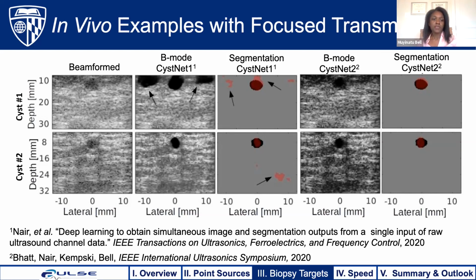So overall, this is very exciting for an autonomous biopsy system, if we want to emphasize the structures of interest, such as the cyst, and de-emphasize the speckle texture. And it's also great for showing that once we build these networks, if we get someone or some other application that requires us to preserve the structure that we initially discarded, we can recover that information just with a simple change to the input layer.